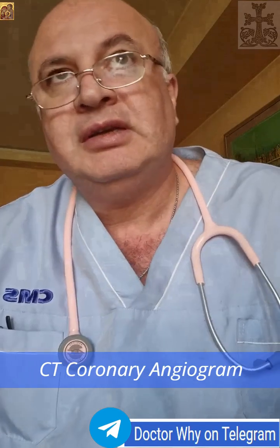So when it comes to diagnosing coronary artery disease, we often think of invasive angiography, catheters, contrast injections, fluoroscopy. But here is the most interesting fact. A computer tomography coronary angiography, CTCA, can visualize the coronary arteries with over 95% accuracy without ever entering the body. That's right. Absolutely. It's a non-invasive, high resolution, 3D look at the coronary vessels, allowing us to see even early atherosclerotic plaques long before they cause symptoms of ischemia.